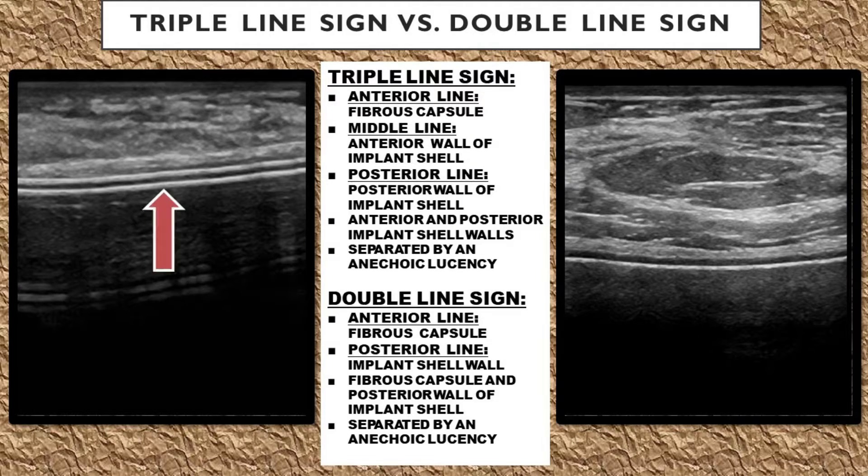Some implants have an implant shell composed of two layers, which forms a triple line sign on ultrasound. The anterior line is the fibrous capsule the body makes around the implant, the middle line is the anterior wall of the implant shell, and the posterior echogenic line is the posterior wall of the implant shell. The anterior and posterior implant shell walls are separated by an anechoic space called an anechoic lucency.